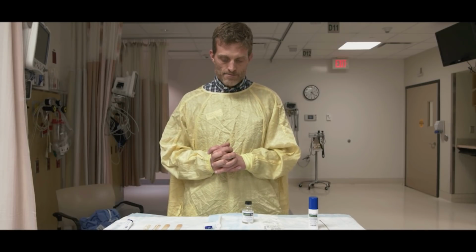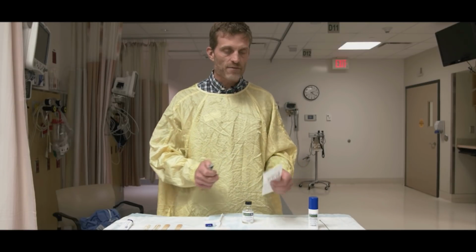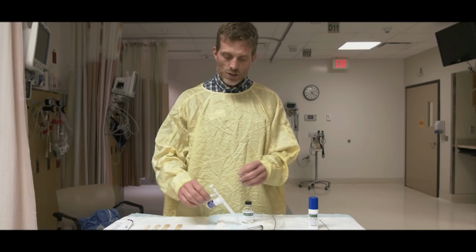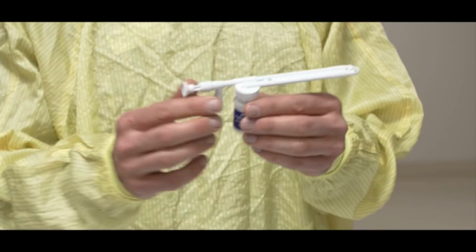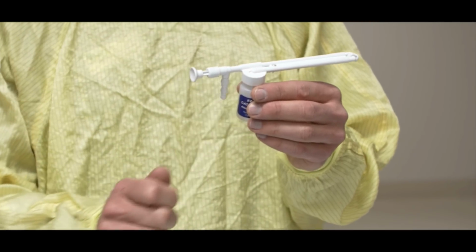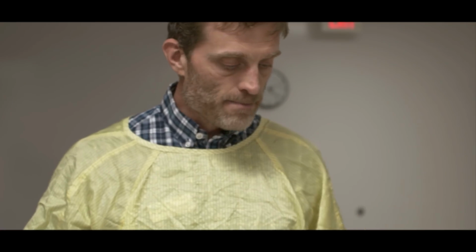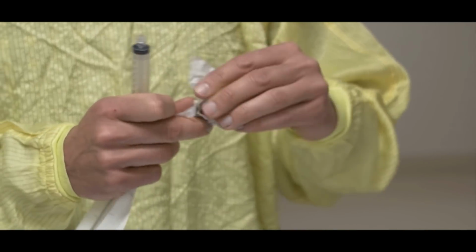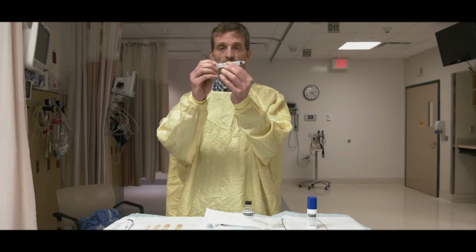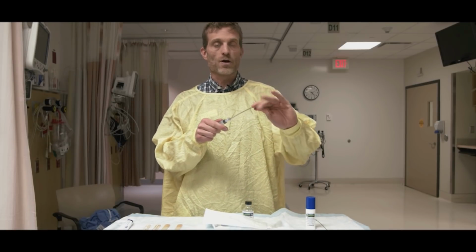So these devices, people are always interested in the actual atomizers. The two devices we have here in Calgary, this is made by Alcove Medical. It's called an Easy Spray. You saw how easy it was to use. You simply hook that up to 8 liters of either air or oxygen, and then just depress that. The other device is a malleable tip that simply slips onto the end of a 10 cc syringe. So again, you put 4% in the 10 cc syringe. This just luer locks here, and this is directional. You can point it to wherever you want to go.